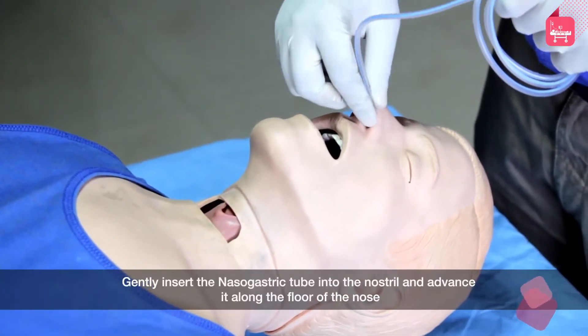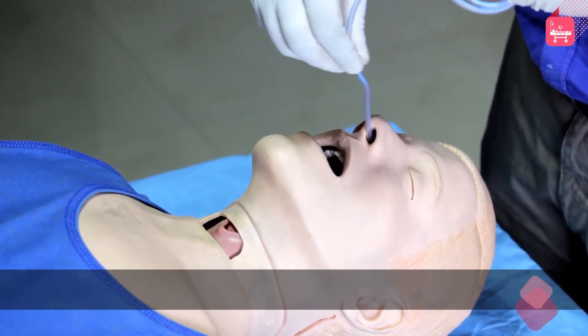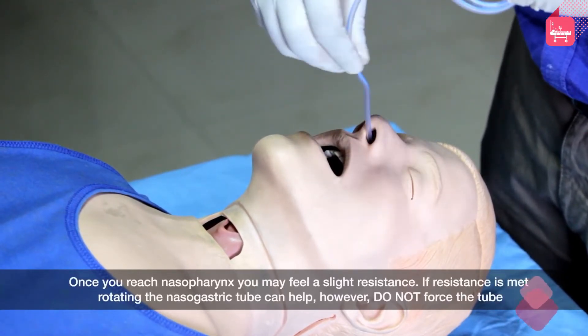Gently insert the nasogastric tube into the nostril and advance it along the floor of the nose. Once you reach the nasopharynx, you may feel a slight resistance. If resistance is met, rotating the nasogastric tube can help. However, do not force the tube.